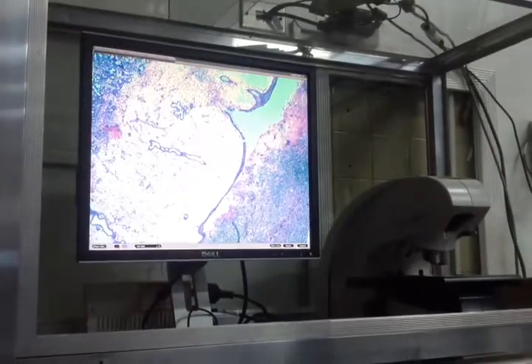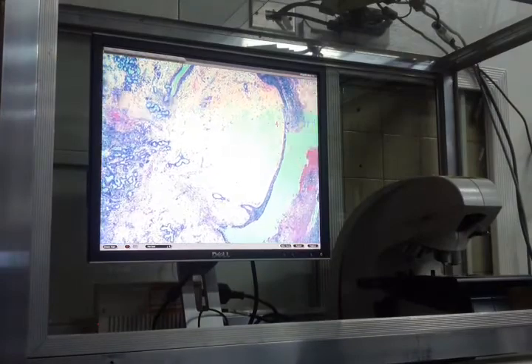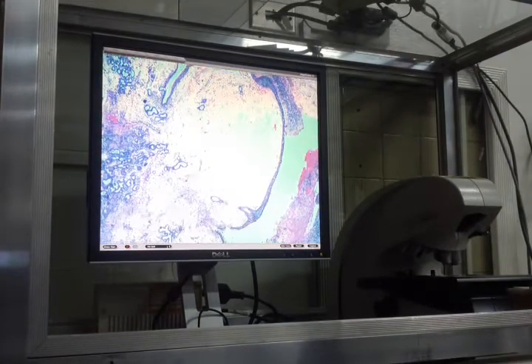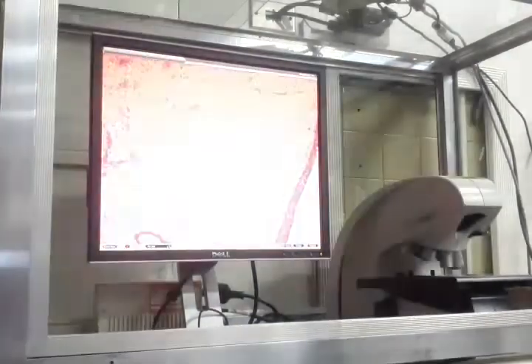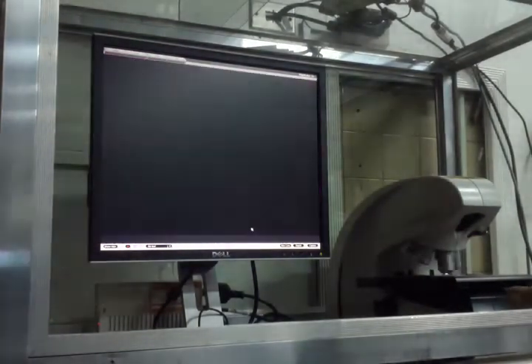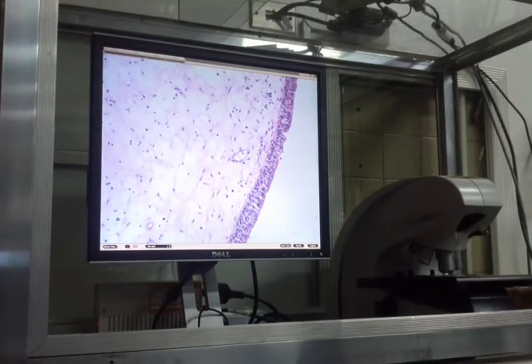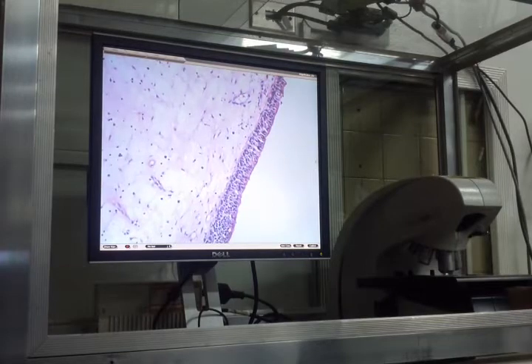Tama? One of them is this. It is edematous. It has an edematous stroma. It's lined by lining. That's an edematous stroma. The lining is pseudostratified columnar with goblet cells and cilia. So that's the respiratory epithelium.